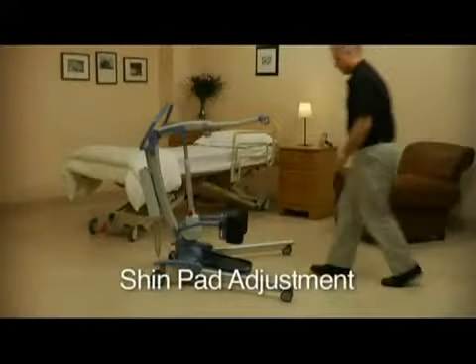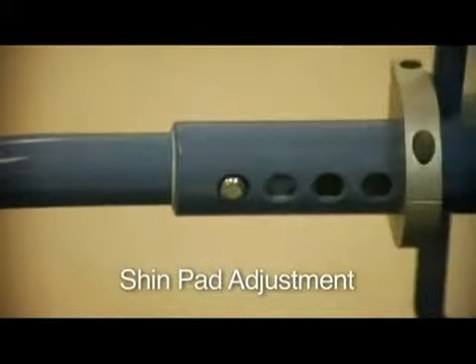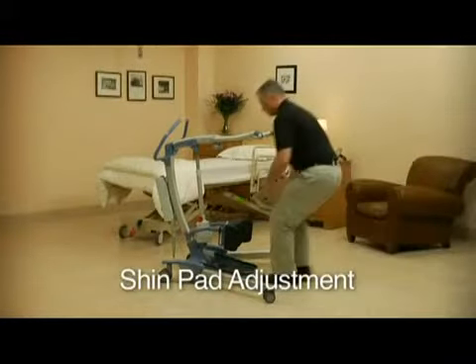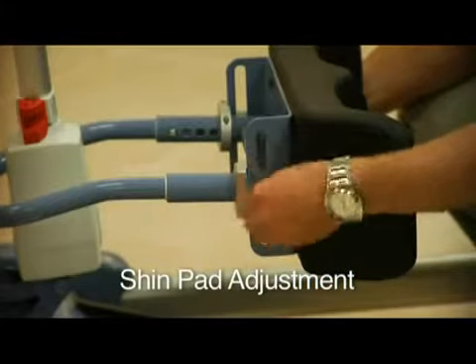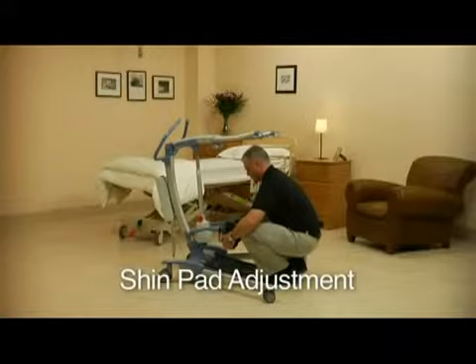The shin pad should always be positioned just below the client's knee pad. To adjust the shin pad, loosen the lever on its side, position the shin pads at the desired height, and then tighten them. It is also possible to position them horizontally — simply pull the appropriate levers out and adjust accordingly.